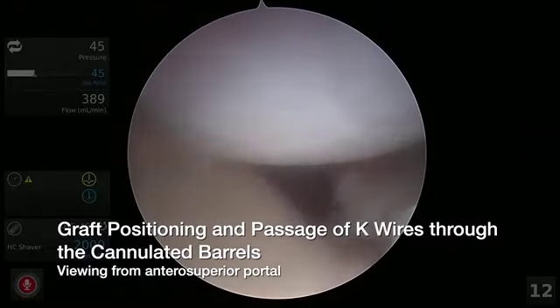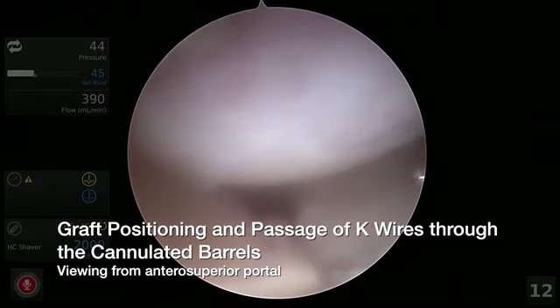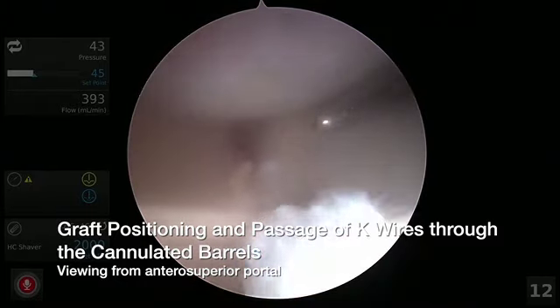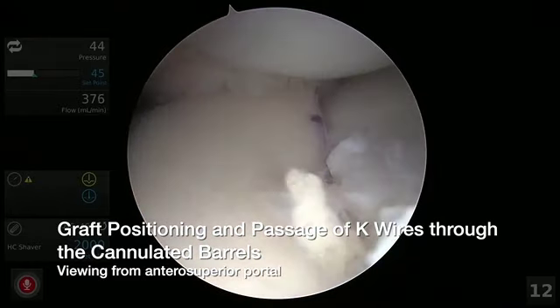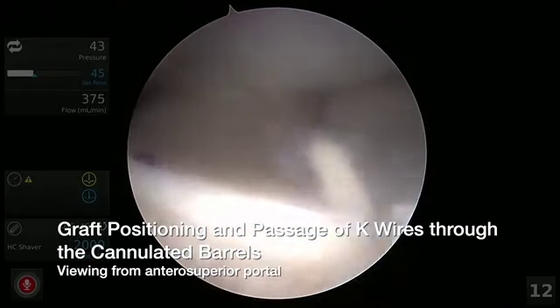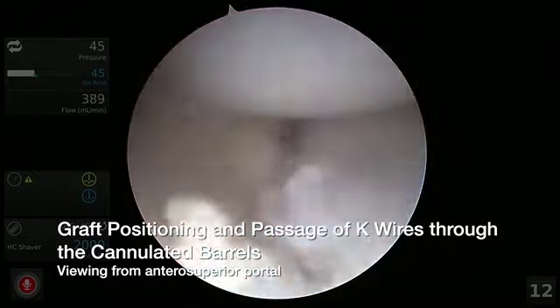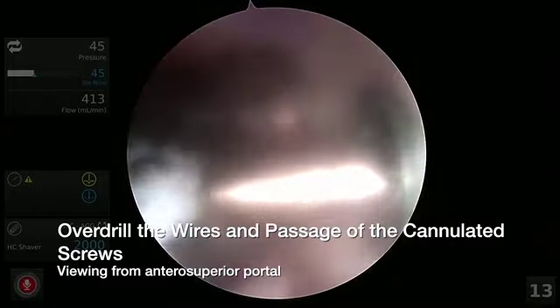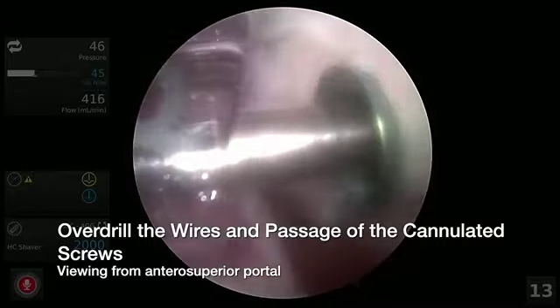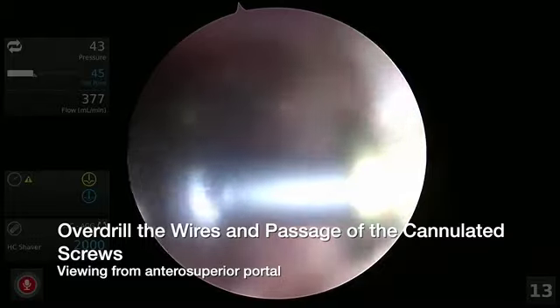Once the graft is inserted and positioned on the anterior glenoid rim, we first aim to get the appropriate position in the superior-inferior plane and secure it in place with 1 wire. We then align the mediolateral and rotational angulation prior to inserting the 2nd wire once satisfied with the position. We then drill over the K-wires bicortically, measure the screw length, and insert cannulated screws of appropriate length to hold the graft securely in place.